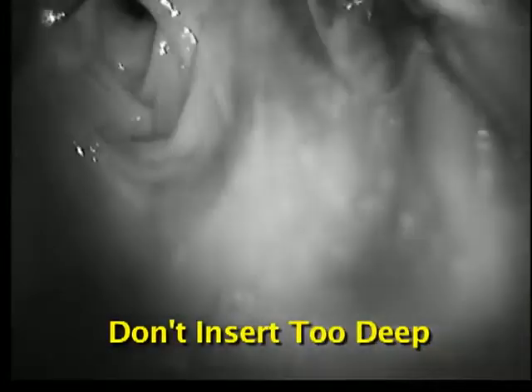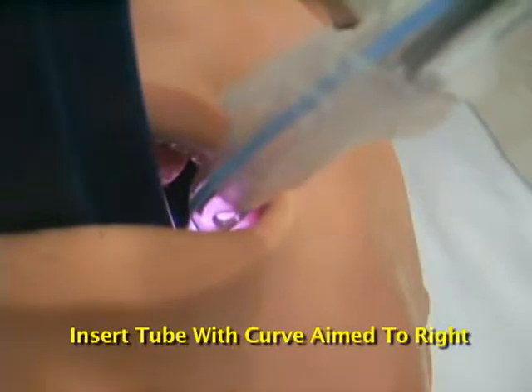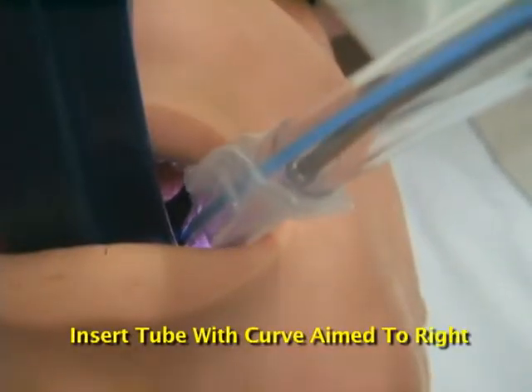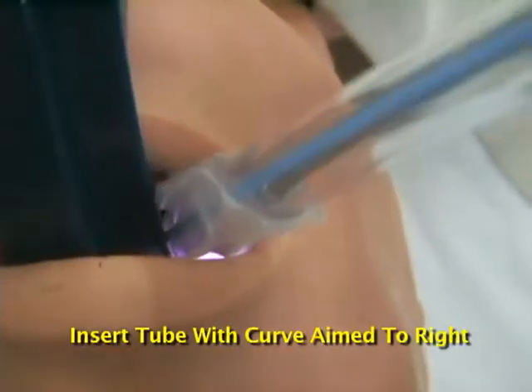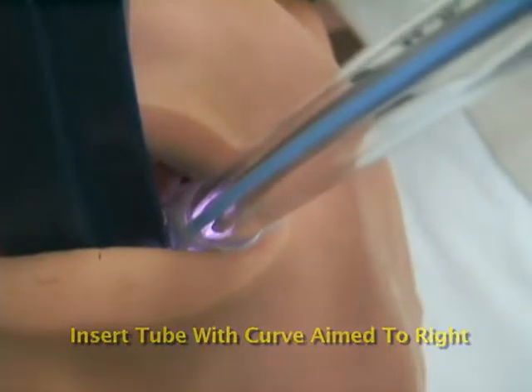Don't insert the GlideScope too deep. Insert the endotracheal tube under direct vision with the curve aimed toward the right side of the mouth. This keeps the tip from tangling with the blade.